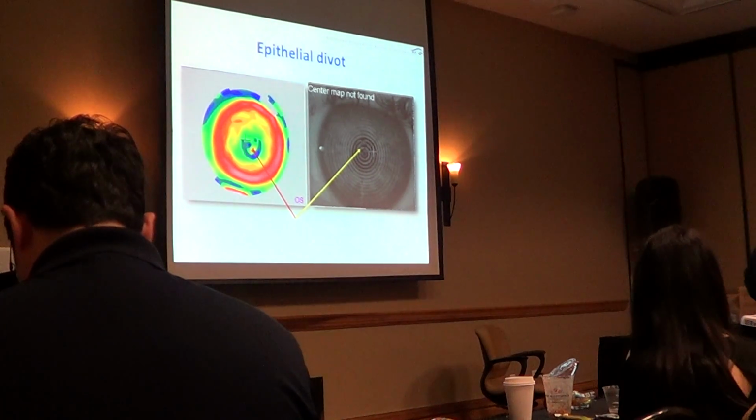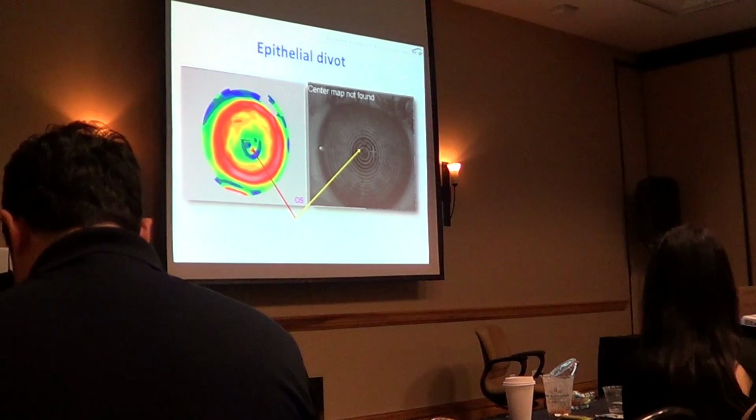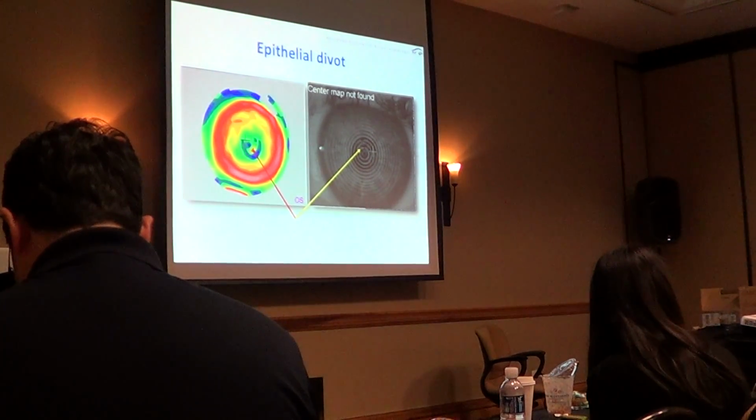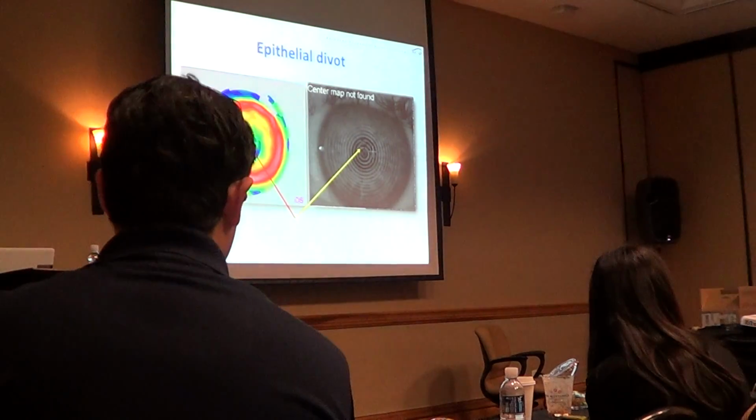By the way, it's the way we do with trial sets. When you change one lens from the trial set one step, you are changing all the curves one step. So it's the easy way. Then you could move on to do a tuning.